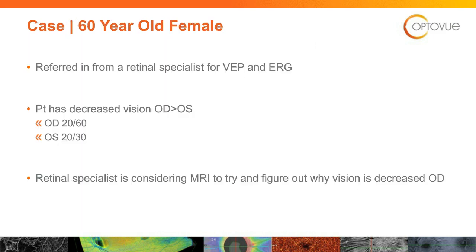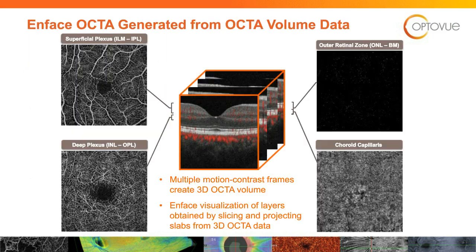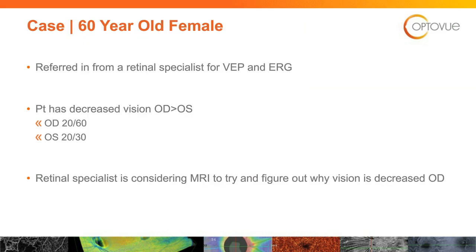And I like this because it gives you the ability to look at different layers within the retina from directly straight on. We all are familiar with fundus photos, where you can take a look and you can see the anatomy. Well, now you can go layer by layer by layer in en-face imaging. This is useful in more than just diabetes and diabetic vascular disease. During my talks, I always introduce en-face imaging with this case, and that has nothing to do with OCT angiography, but it introduces the technology in terms of those en-face images.